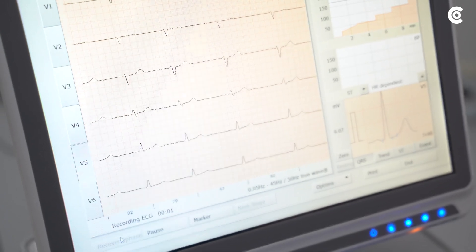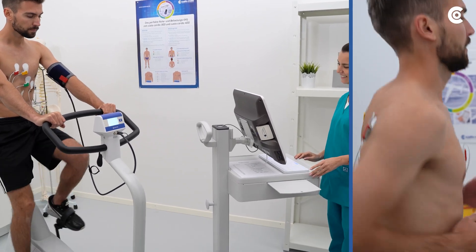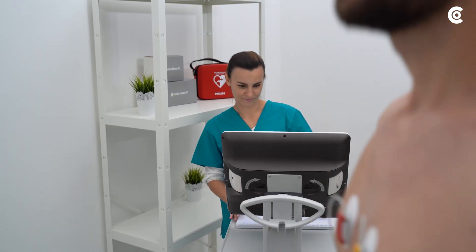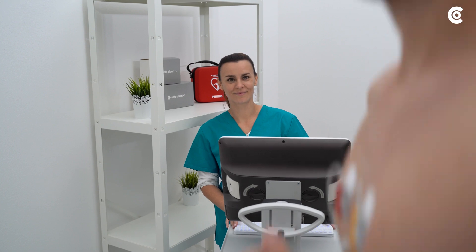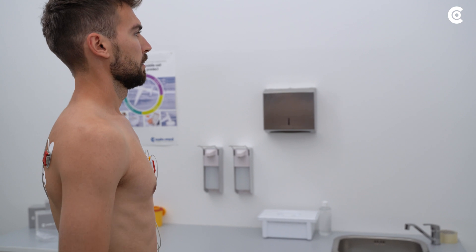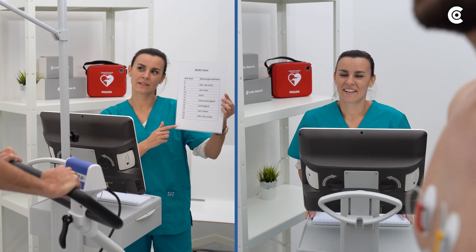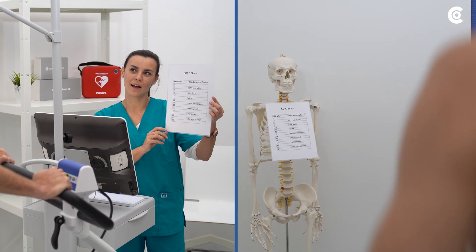Start the examination and guide the patient through the individual phases. Always take care of the patient's condition and values. Interrupt the process with upcoming overload of the cardiovascular system as well as other indications of overstraining. Conduct the interrogation according to the Borg scale during the measurement.